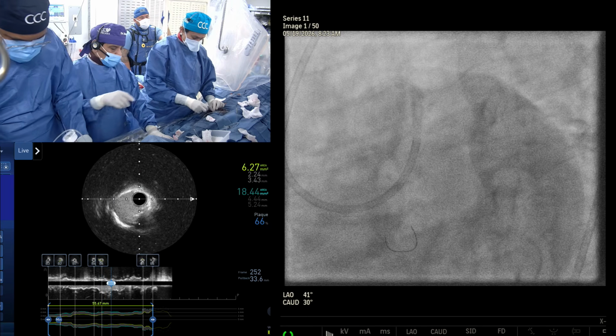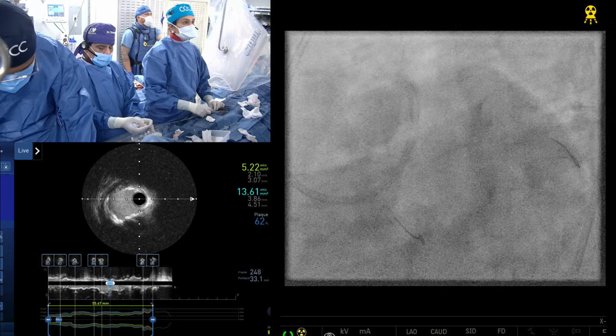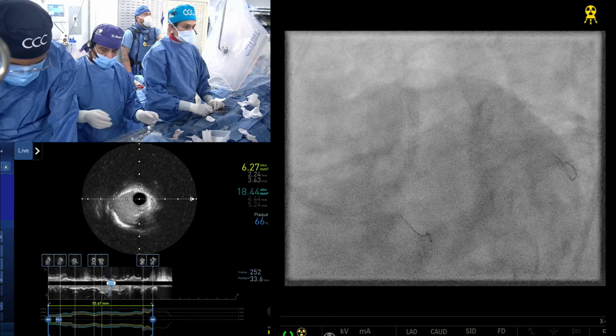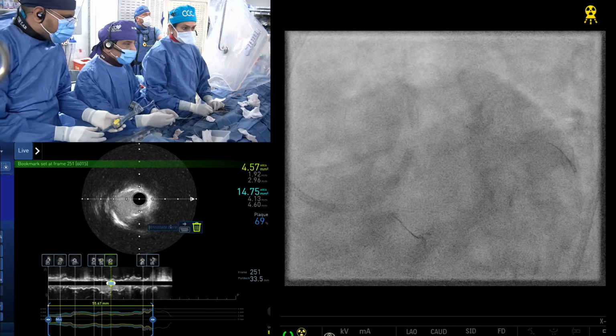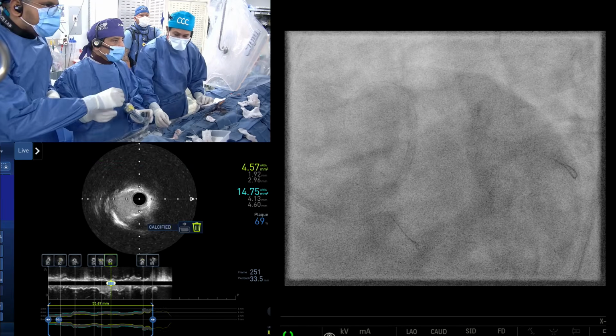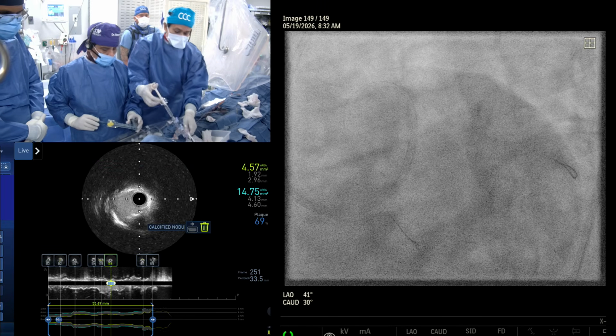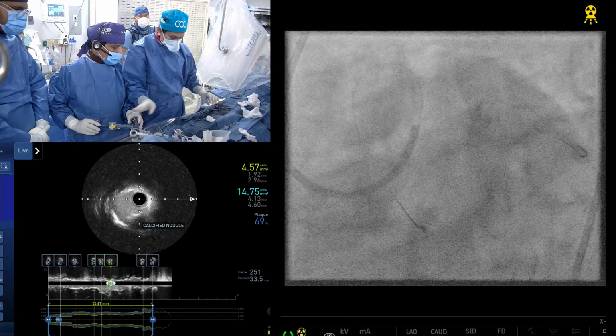So now we are doing the distal, whether we call it OM1 or so, with a high-pressure non-compliant balloon followed by stenting. That will be our goal now. But this is a 20 millimeter balloon? No, 12. Okay. We had a 20 open for the... Good. Okay, go.